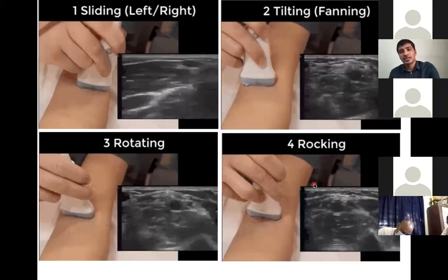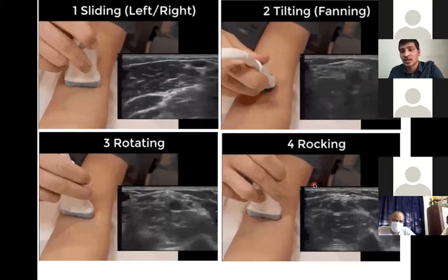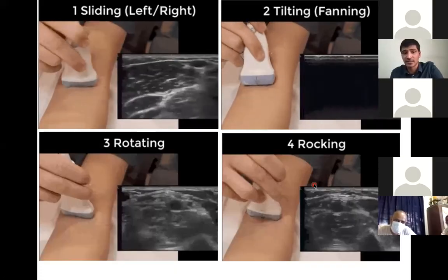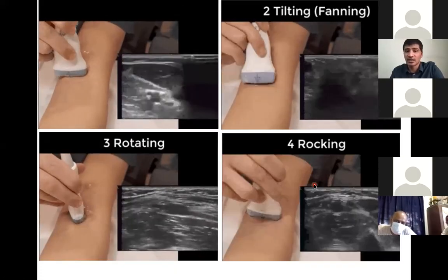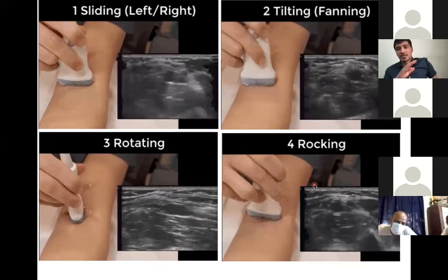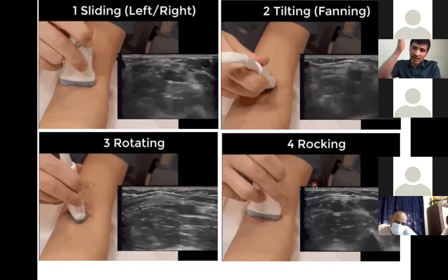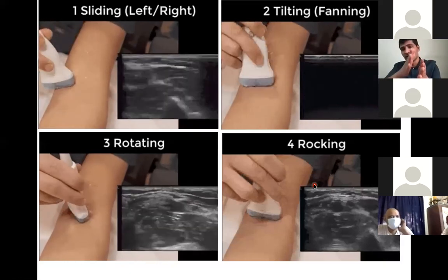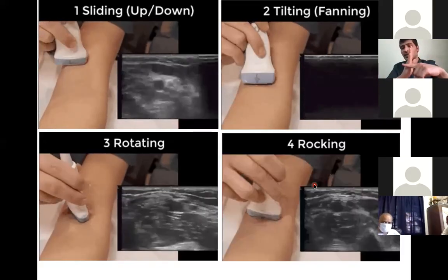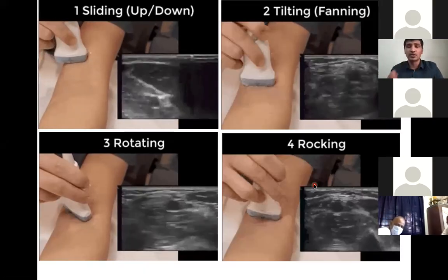So this is the first probe motion, which means it leaves the place. The second is it doesn't leave, it's just tilting. And the third is rotation, right? So we can rotate, because it is not the X-ray image I told you about earlier. It is a cross-sectional image, because at one point the sound wave sections the object and it gives the image. So if we are sectioning at this point, we get one image, and if we are sectioning at this point, we get a different image. So this rotation is also very useful.